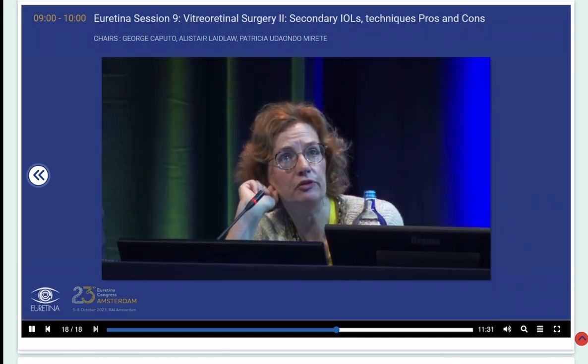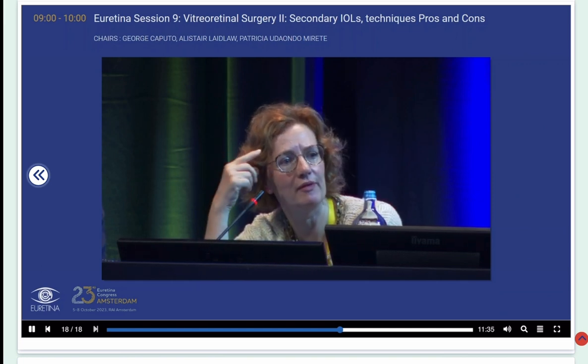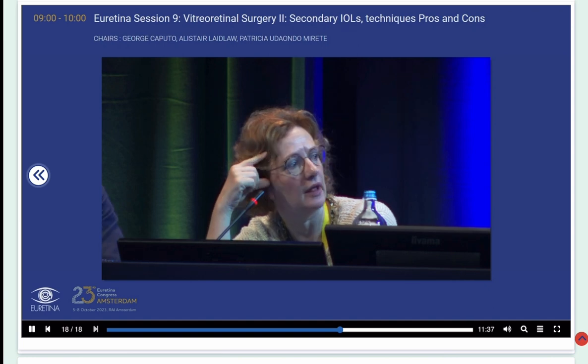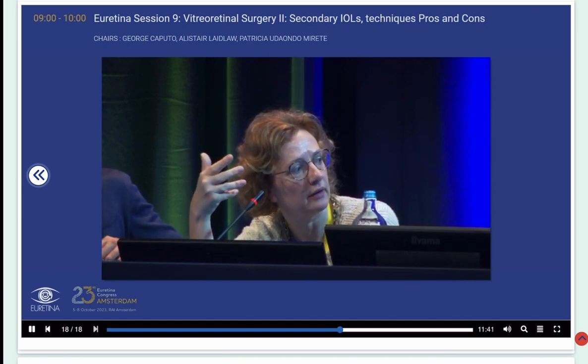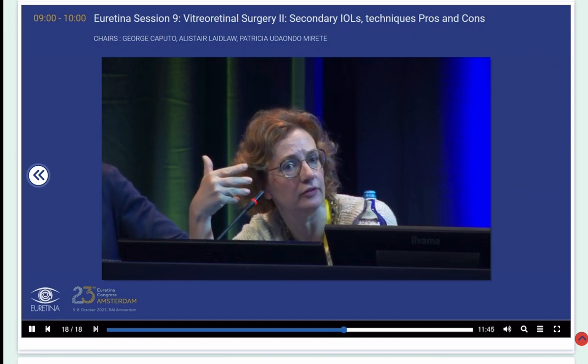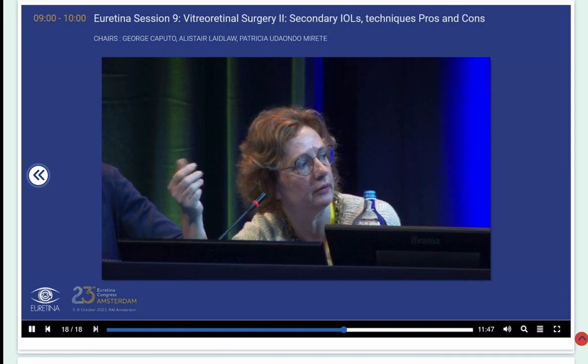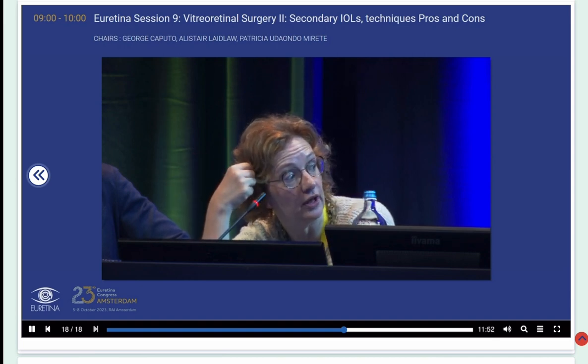I suppose it's used in valve surgery, so I suppose we've got good long-term evidence that it is stable, and it's used in cardiovascular surgery as a suture that remains in place for valve surgery. So as a material, I think we've got good evidence that it works well and it will stay long.